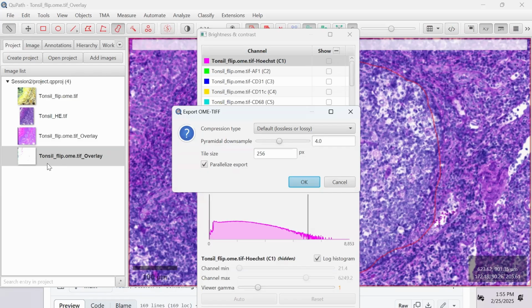Right? Could you repeat that question, please? So this works for H&E stained images, but what about other histologic images like PAS or Masson trichrome? Works exactly the same way. The image combiner doesn't really care about this that much. I guess it's important in terms of finding structures that you can relate to each other.